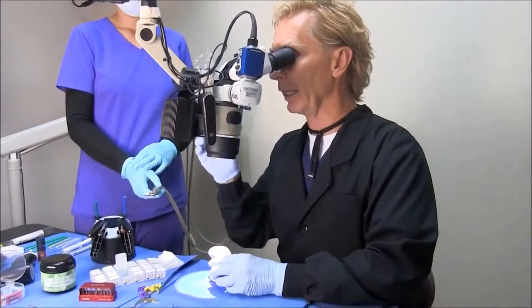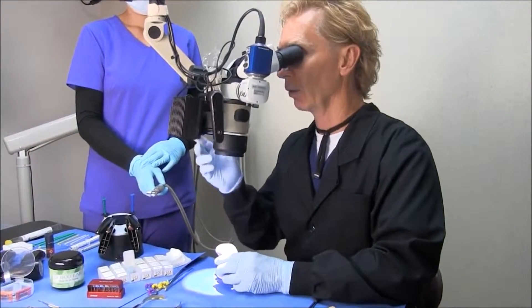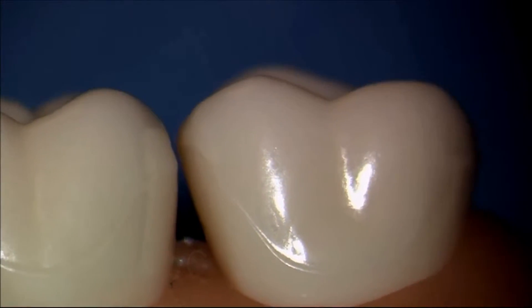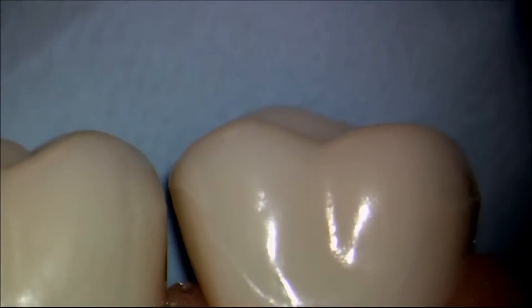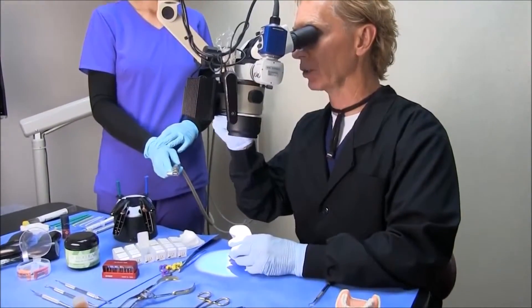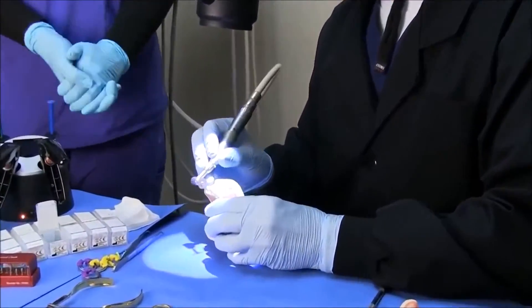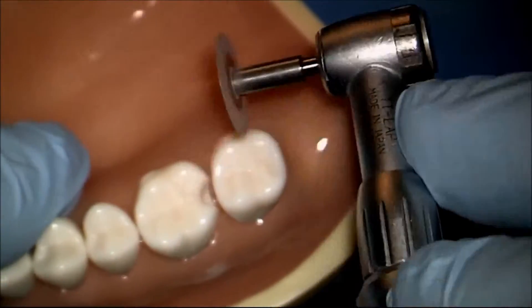The first thing we want to keep in mind is that a lot of naturally occurring contacts are what we call a kissy contact. In this particular case, the contact is really too high on the occlusal, and a lot of contacts are naturally not very smooth. What we like to do is take a disc and flatten and smooth the neighboring tooth.